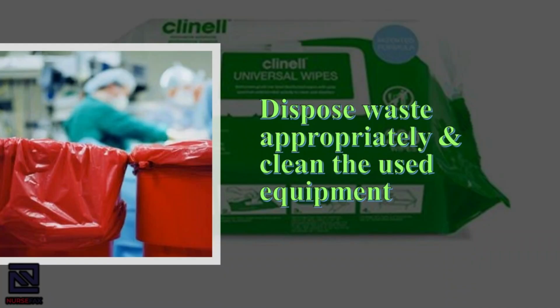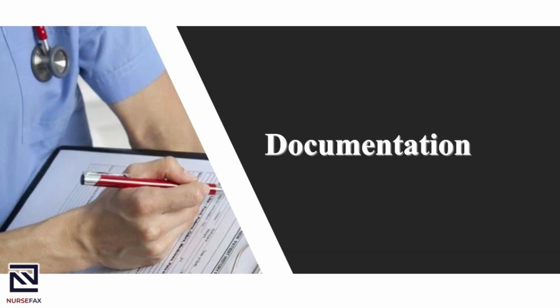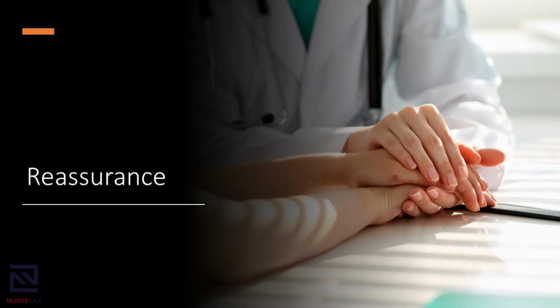Post-procedural phase. Waste disposal and cleaning, discarding the waste appropriately following the waste management policy. Cleaning the equipment used using the clinical wipes. Remove PPEs and clean hands with hand rub or soap and water as required. Documentation. Document the findings and administration record. Check date, name, signature and sign.